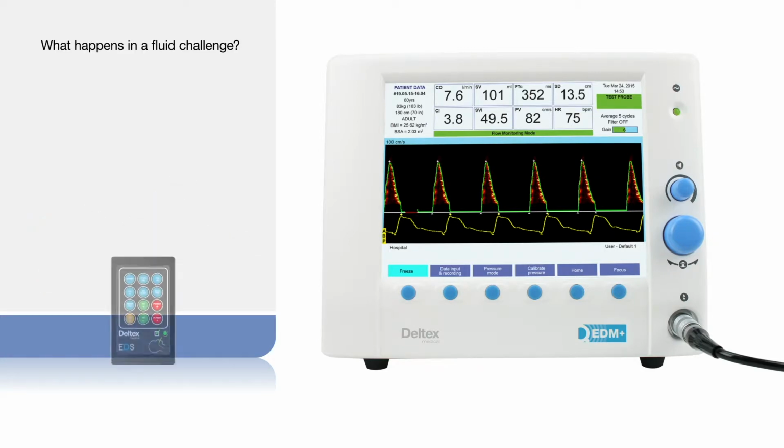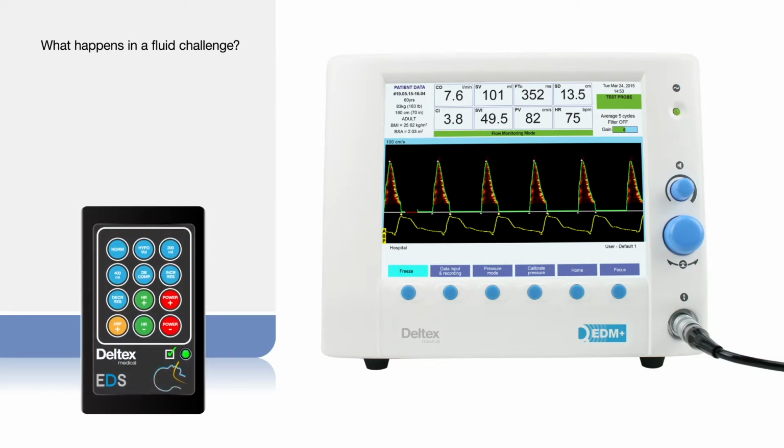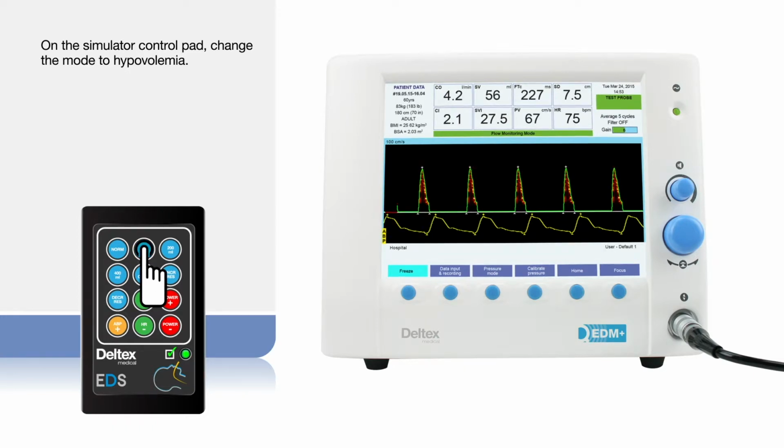Now let's look at what happens in a fluid challenge. On the simulator control pad, change the mode to hypovolemia. You will notice that the wave has become smaller and narrower.